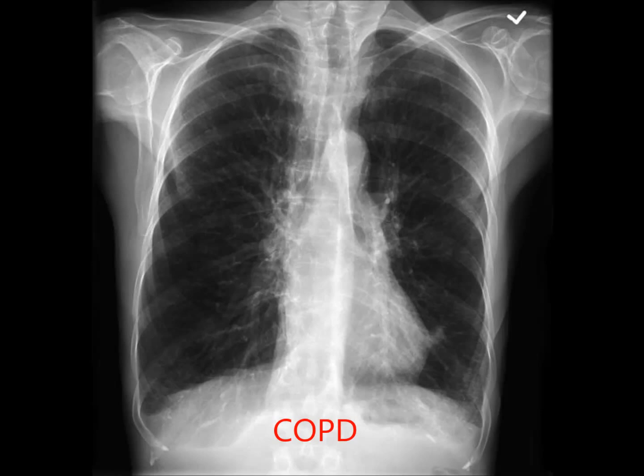The blunted costophrenic angles are a little bit of a red herring — they're actually the result of the flattened diaphragm. The areas of opacity in the hyla are likely due to calcification of pulmonary blood vessels, so I would strongly suspect that this patient was a heavy smoker. Smoking is bad for you, and this is what happens — so the lesson is: don't smoke.